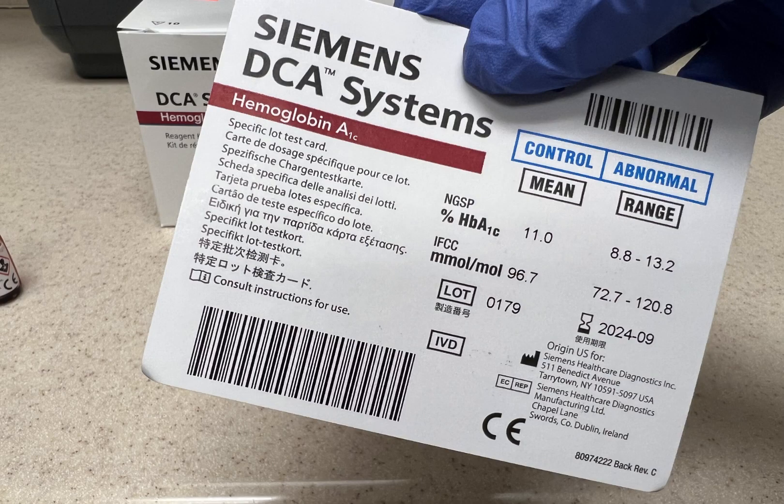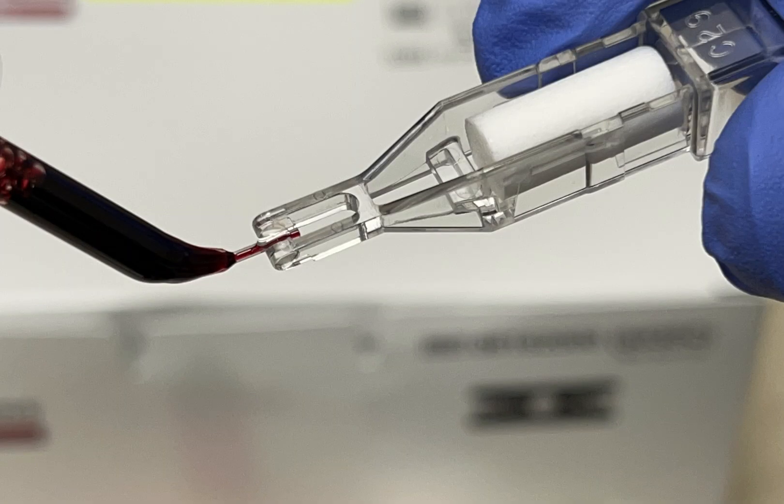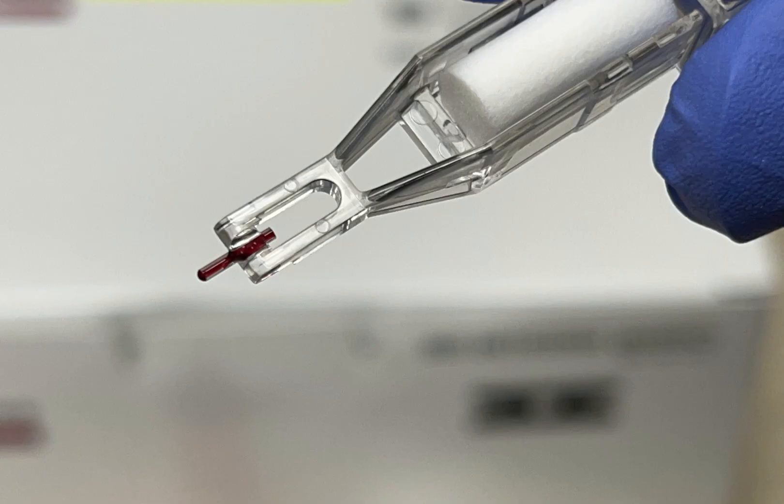Scan the abnormal blue side of the card. Apply the abnormal control sample to the capillary collection device. Make sure there is no gap or overflow in the capillary device.